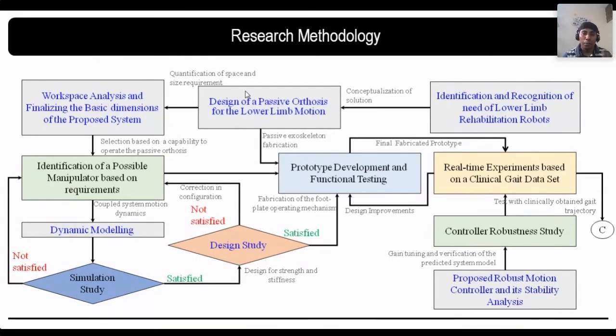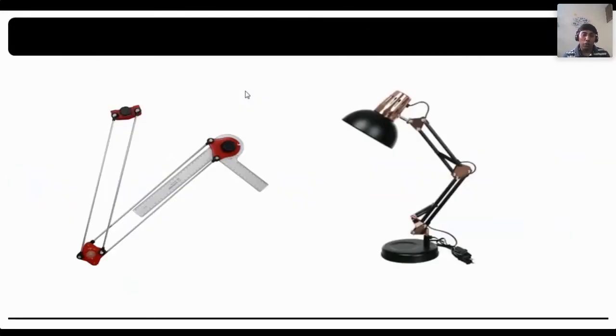But when we talk about the first stage, we talk about the static balance system. I put two things here just to draw your attention. You all notice that the mini drafter is by default an engineering product, right? Any engineer who does engineering, at least in first year, has to carry the drafter. So one can ask why the drafter has two parallelogram mechanisms. It is supposed to be 3 degrees of freedom as a serial connection, but why is it supposed to have a parallelogram mechanism? It is very simple, right?